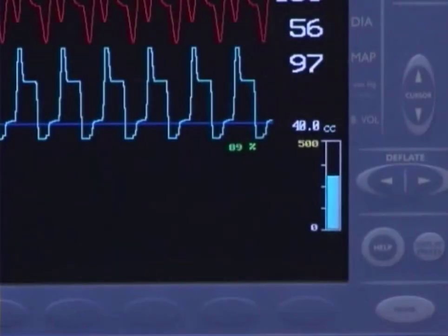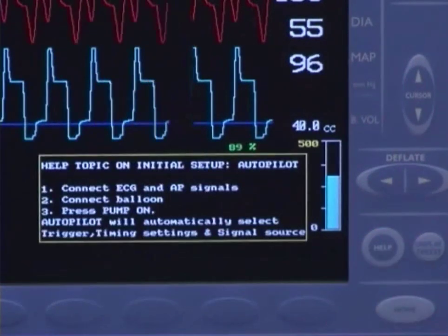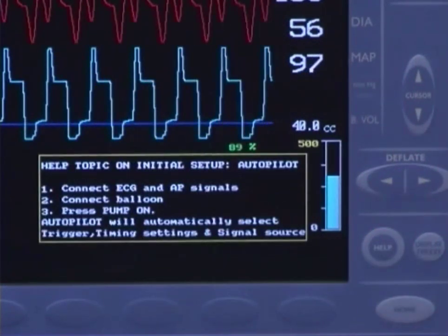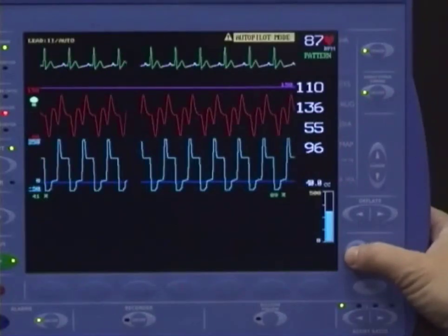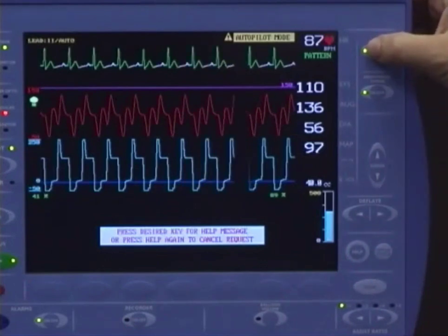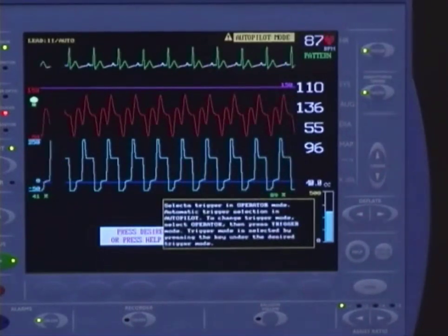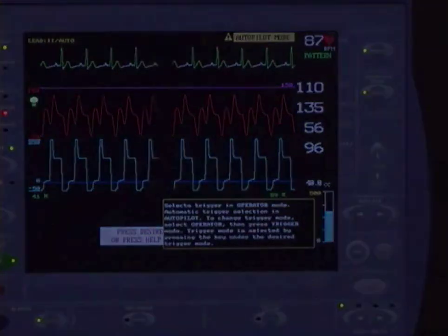There is a Help key to aid you. The first time it is pressed after power-up, it will display the steps needed to get the pump up and running. If you forget what the function of a control key is, press Help and then the key you wish to know about — a message regarding that key will be displayed.